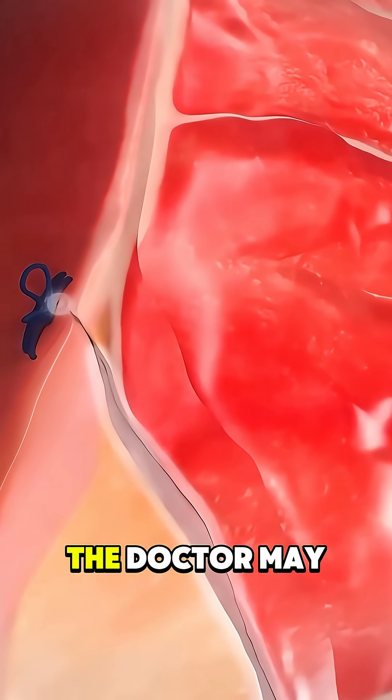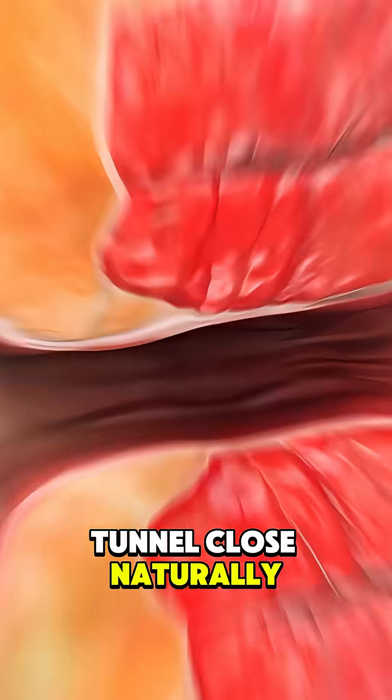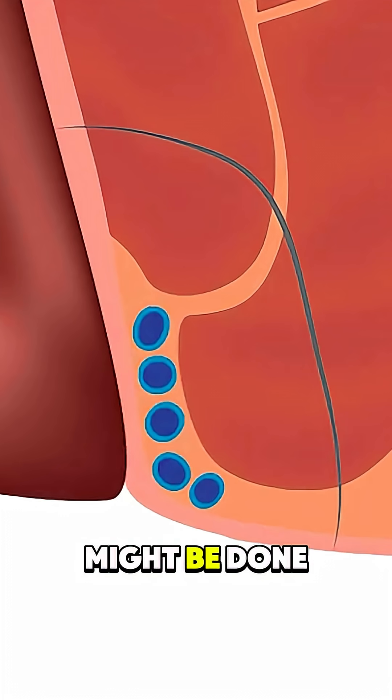In some cases, the doctor may tighten the seton gradually over a few visits to help the tunnel close naturally. Other times, if the fistula is simple and safe to remove, a small surgery might be done instead.